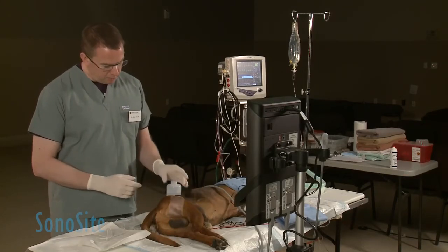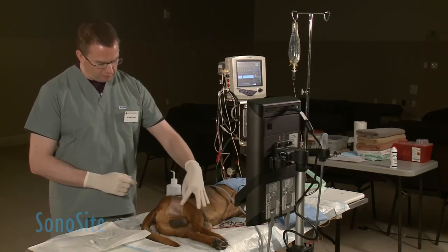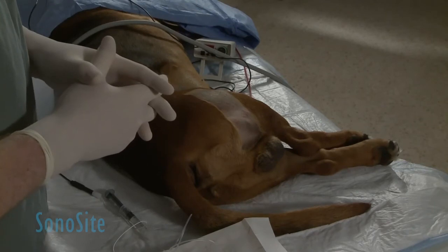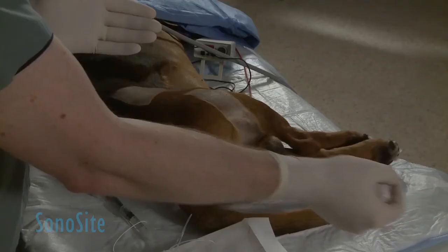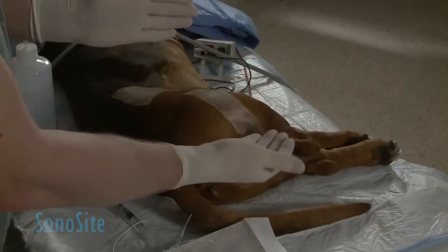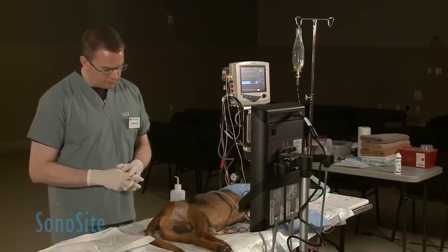What we've clipped today is just an area over the target, with the biceps femoris muscle in the center. In this particular regional anesthetic approach, the needle used to deliver the local anesthetic is going to be entering from a caudal direction, so we've clipped the animal around the back of the thigh to allow that entry for the needle.